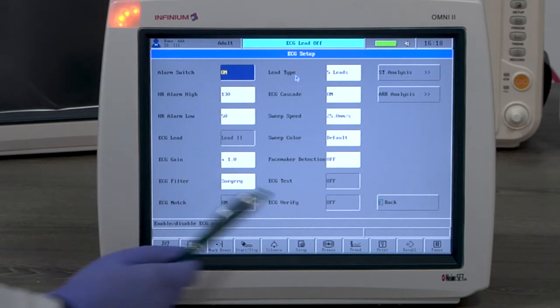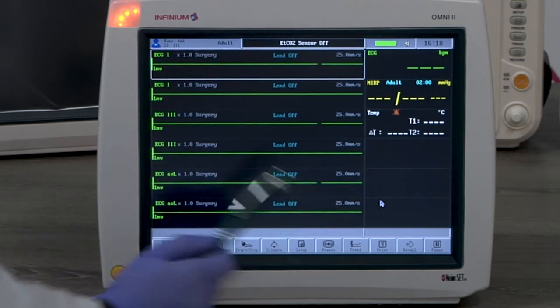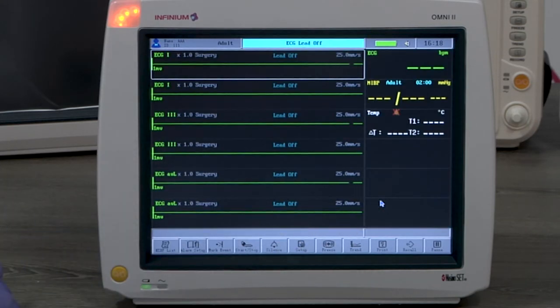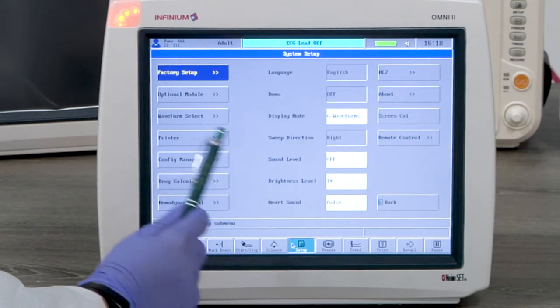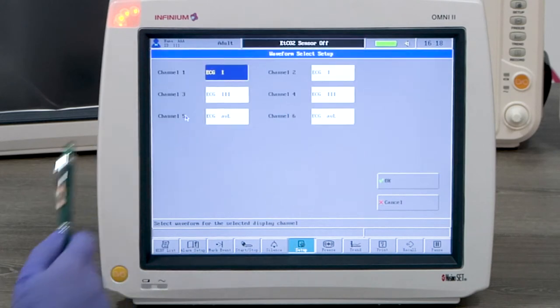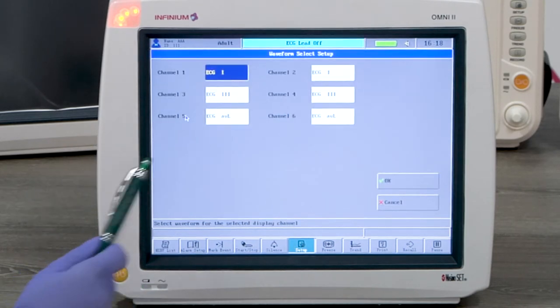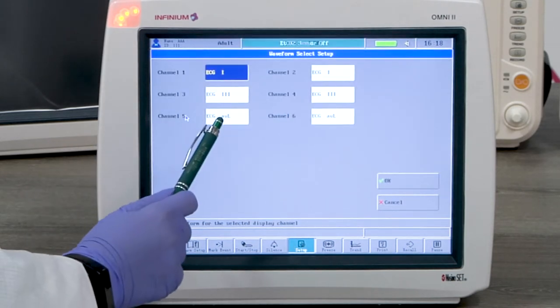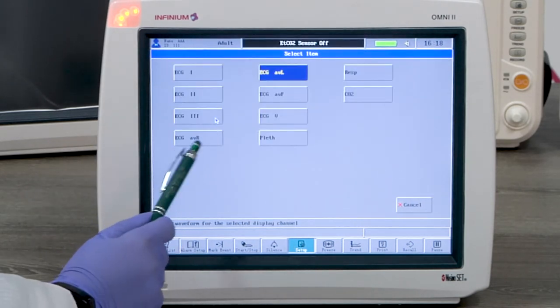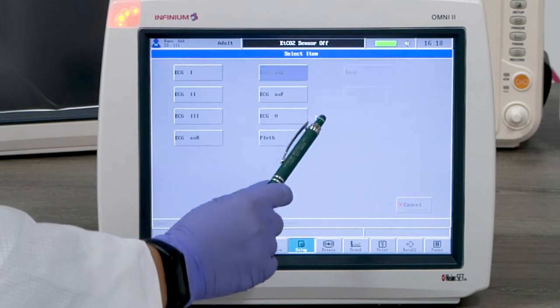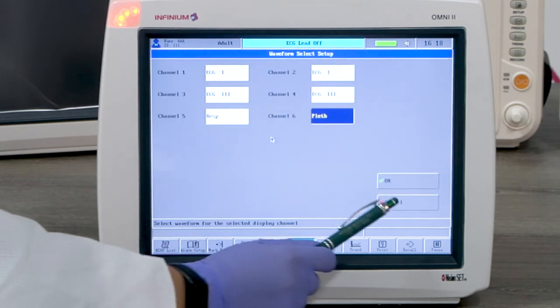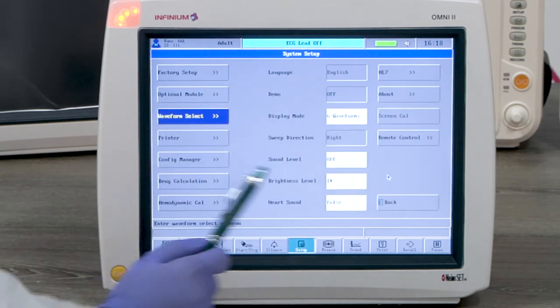Let's look at what you would do when you need to see other waveforms. Go to setup menu and click waveform select. Now select the last two channels to display respiration and SpO2.